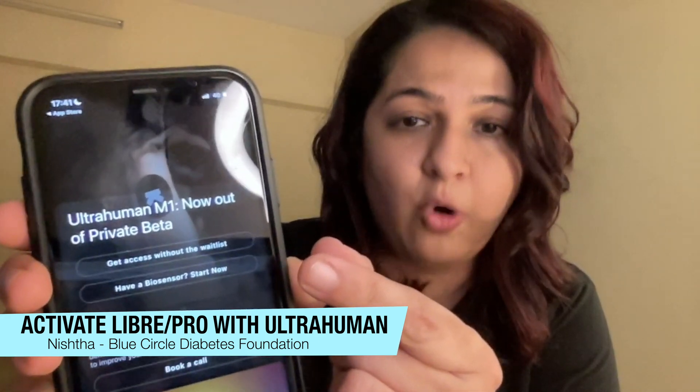When you first download and open the app, you're going to see a screen like this. You need to click on 'have a biosensor, start now' to begin activating your sensor and viewing your numbers. I'm going to be applying the Libre Pro sensor to my arm right now to show you how to activate and start getting readings. For more information on Libre Pro and Libre sensors, the difference between them, and how to apply them, please check out the description below.